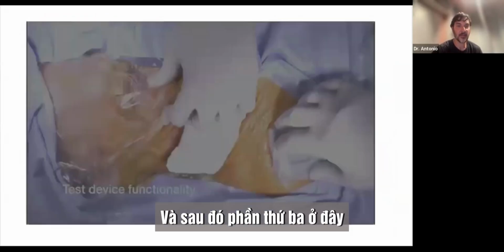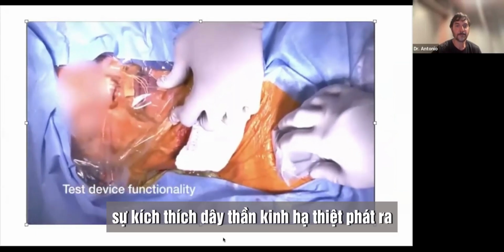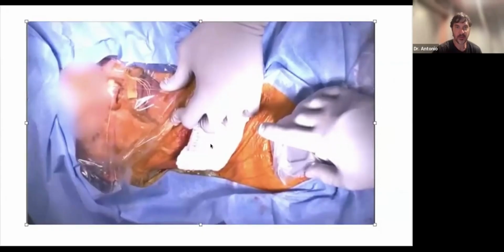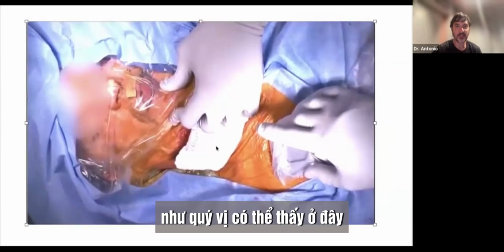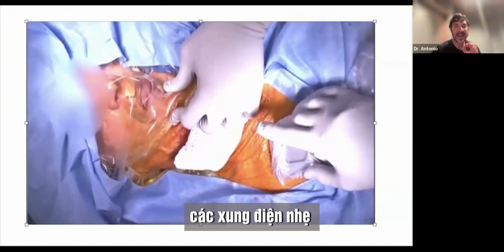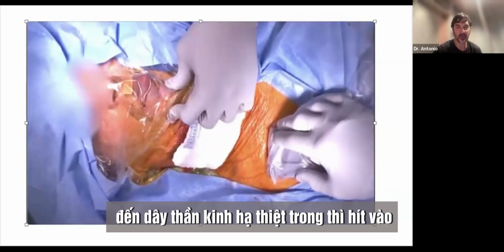And then the third part here, the hypoglossal nerve stimulation delivers, as you can see here, mild electrical impulses to the hypoglossal nerve during inspiration.